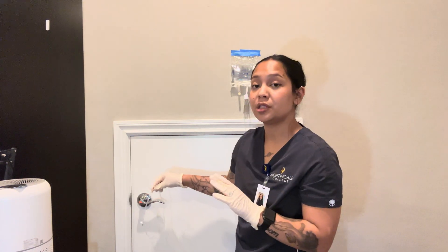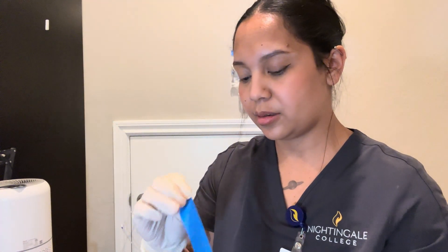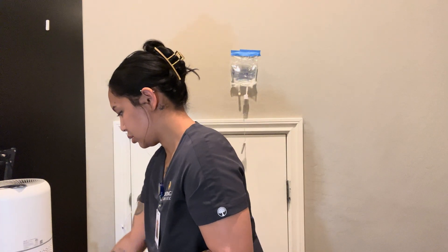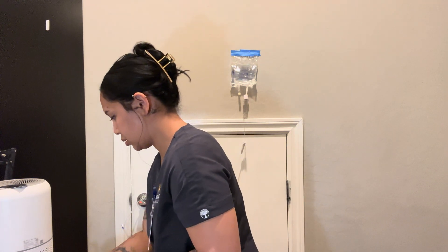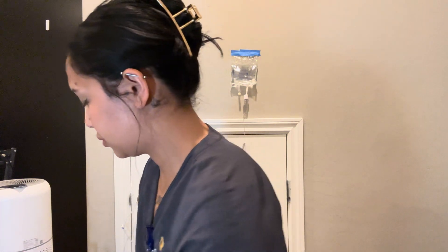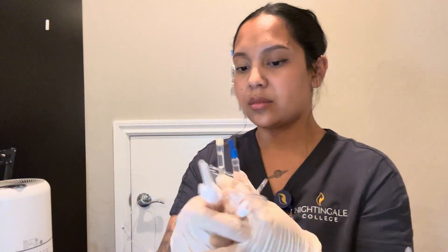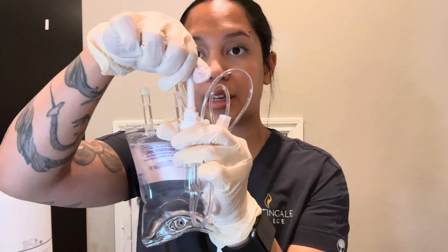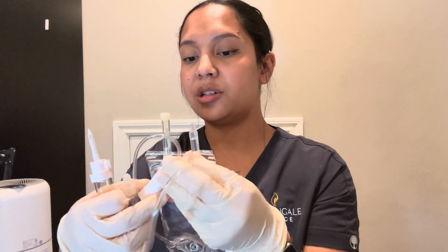Now getting ready to put on the piggyback. Same thing as before — I'm going to go ahead and remove the cap here, and spike my bag, making sure that this is clamped.